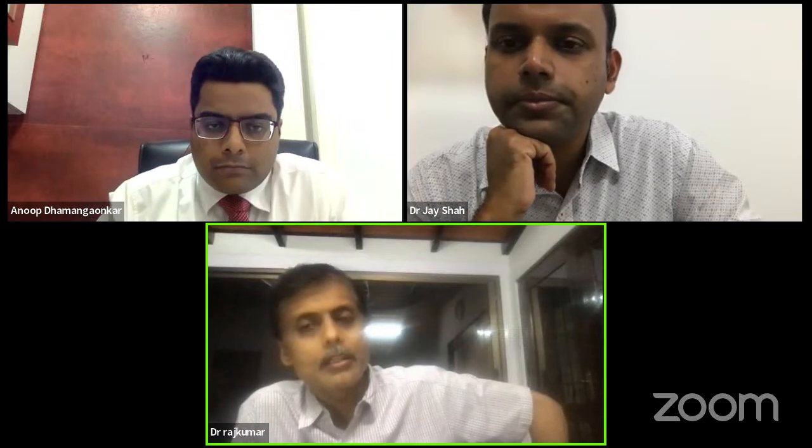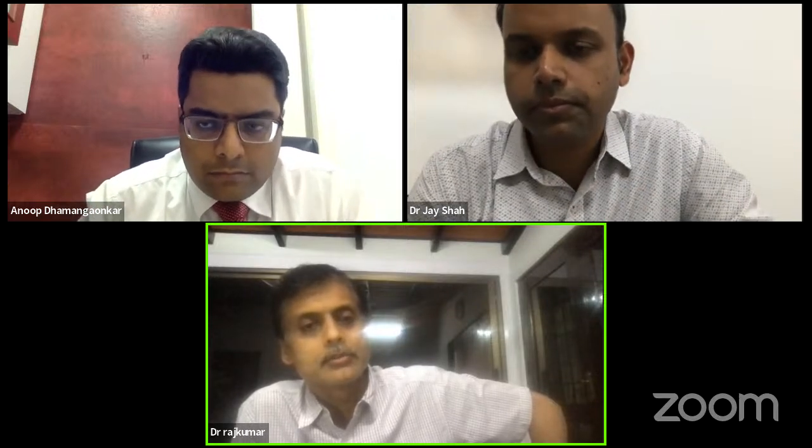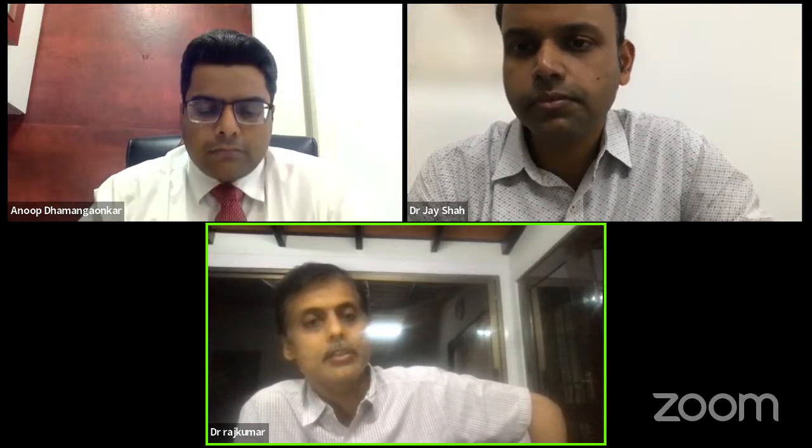Sir, have you ended up using a cup cage construct in any of these cases for a post acetabular discontinuity? Remember, in India, a cup cage construct is only theoretical. You just tell me which company has got a cup cage construct. No. So a cup cage construct is almost like a customizable in the Indian scenario. Our patients' sizes are very, very small. All those cup cage constructs are for Caucasian patients.